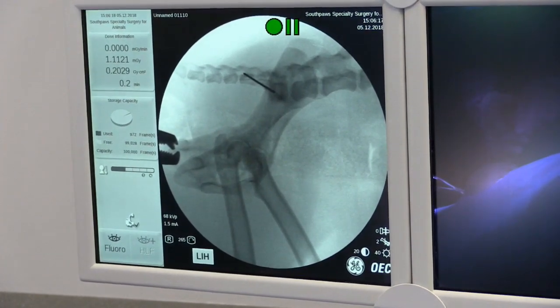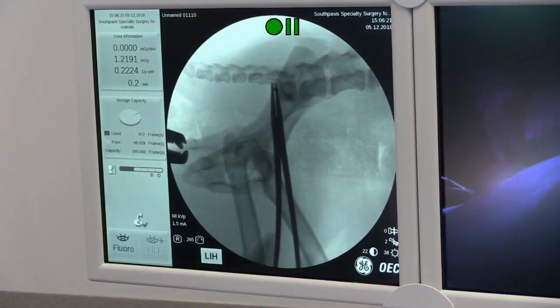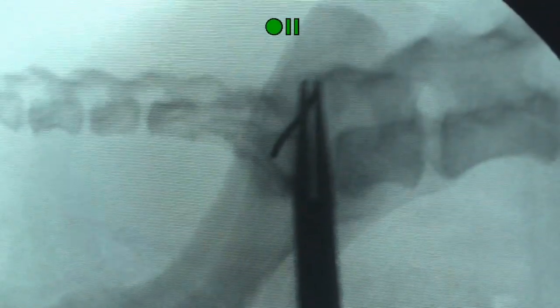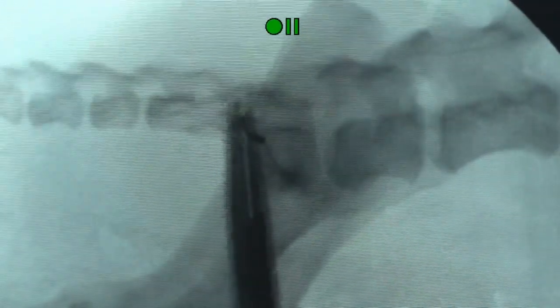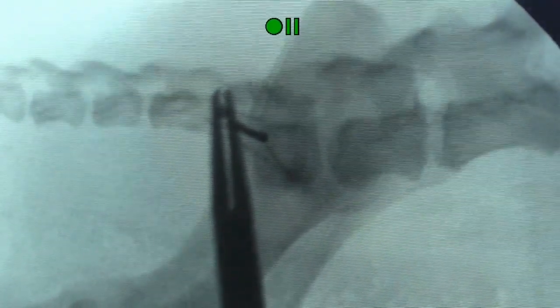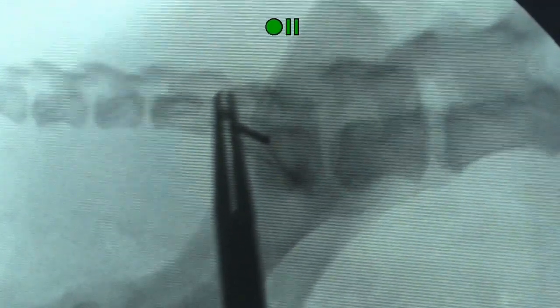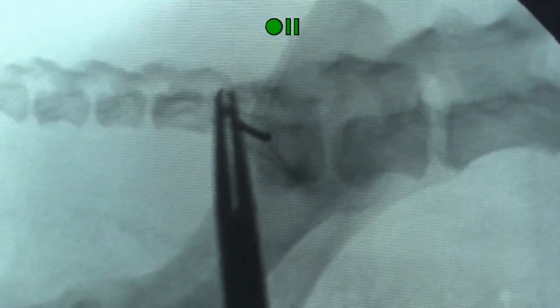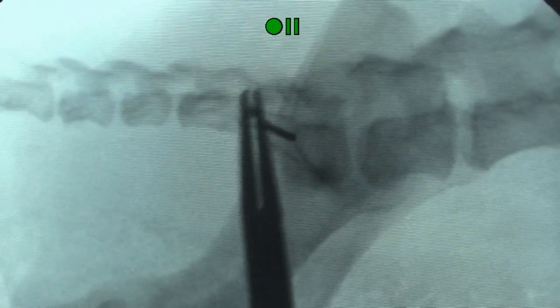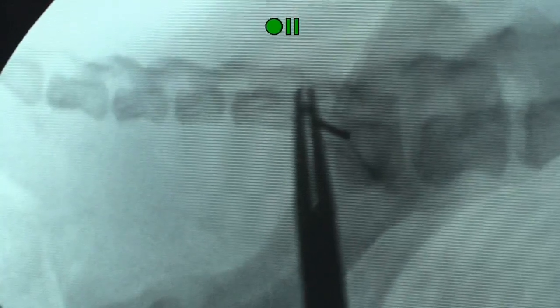So that's the pin that James has put in blindly. And he's going to redirect that in order to get it right down into the sweet spot, which is basically the body of S1. Are you going to use a cannulated screw? Probably, not sure. The benefit of the cannulated screw is that you can drill a hole and then drive the screw right over the pin that you put in there as a positional pin.